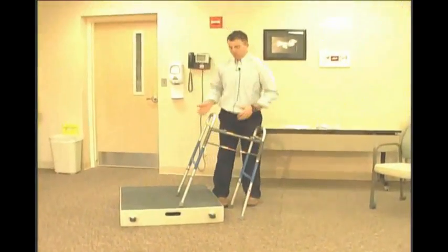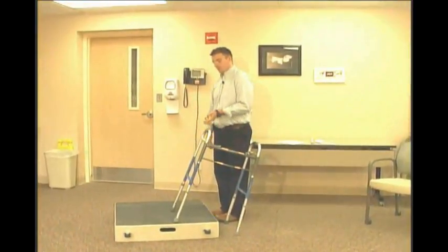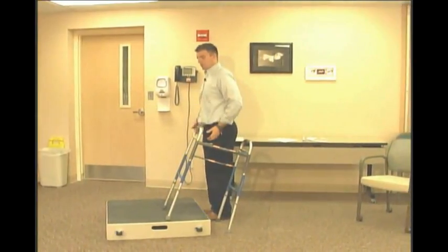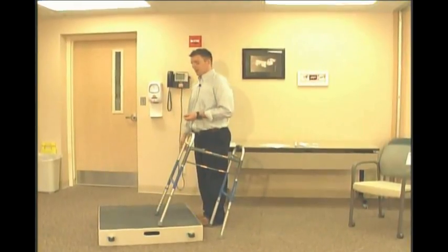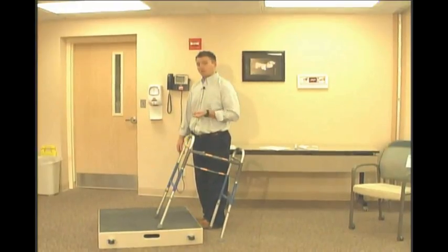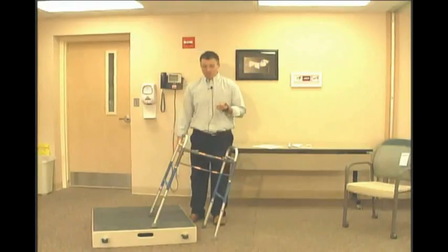Again, too, as you can notice, the walker takes up a lot of room. And so, if need be, we'll give you an education on maybe utilizing a cane for these steps so that you have enough room to clear your hips or your knees to get up onto the step without compromising safety. So this is something that we'll go over while you're in the hospital. And if you have a cane, let us know. We have plenty here at the hospital we can practice with to give you good carryover for home. All right, so that's how we'll be doing the stairs.